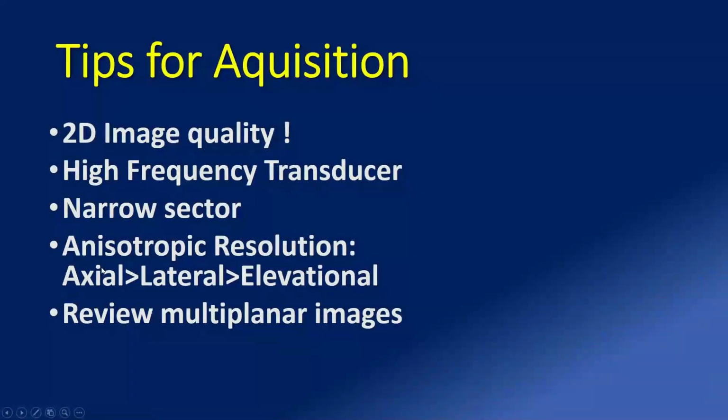It means that we can have a good spatial resolution on the axial plane, but we lose something on the lateral plane, and we further lose something on the elevational plane.